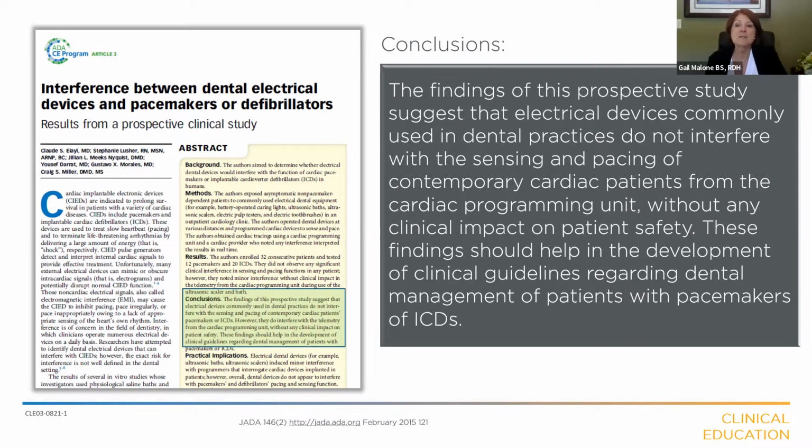What you see here is a study that was published in 2015 in the Journal of the American Dental Association. And it's actually a very important study because it was the first in vivo study regarding pacemaker interference with ultrasonic technology.